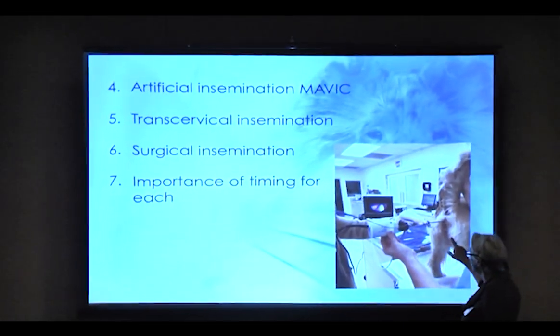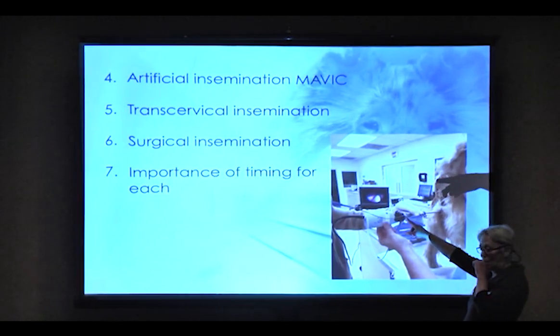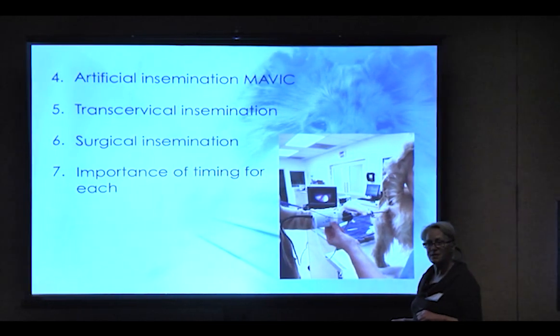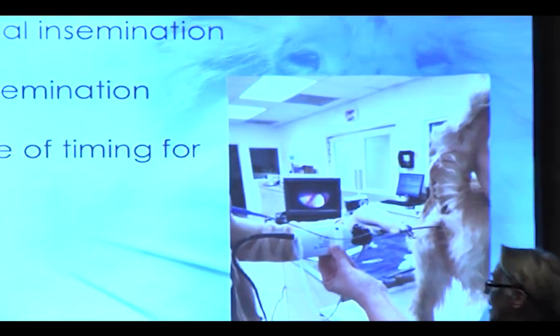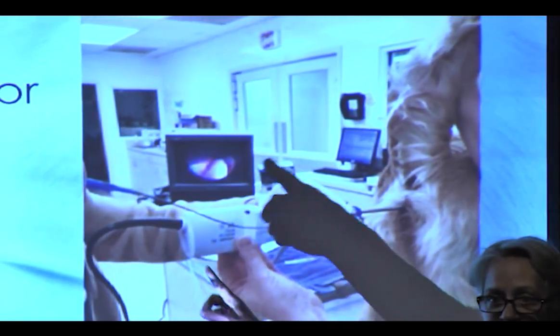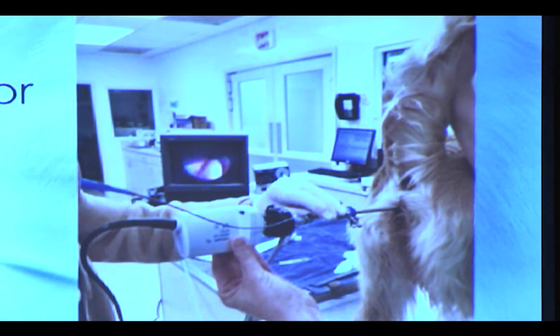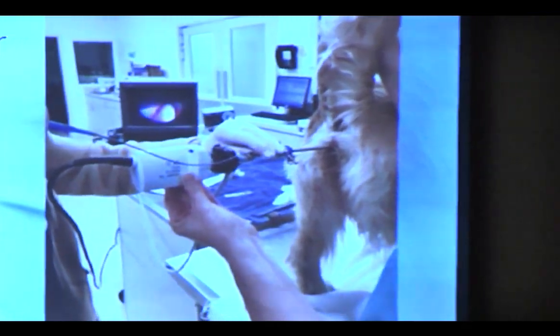Transcervical insemination. We put the endoscope all the way into the bitch. This is what we see on the scope. We have a little TV. The owner usually comes in with us because they love to see pictures, and we like them to watch. And then we have this big tube right here. See this tube? That's where we actually inject the sperm. So we take our scope and we go up and we look through the cervix, and then we take this little tube and we run it right through the cervix, and then we inject the sperm.